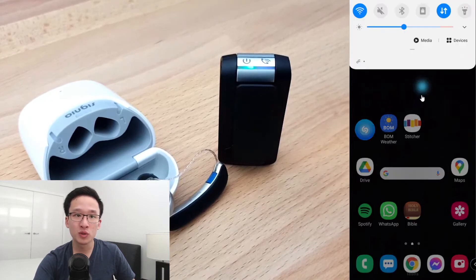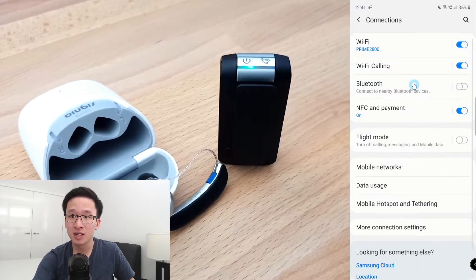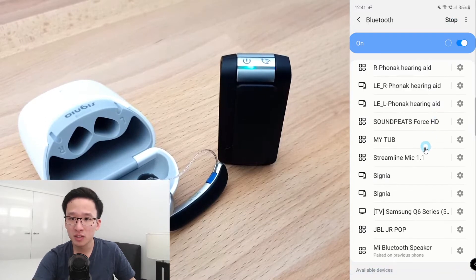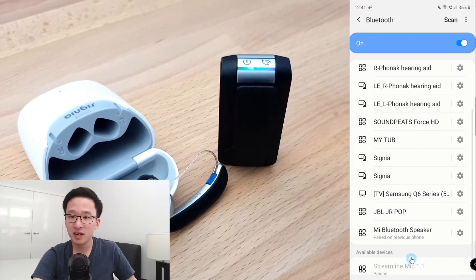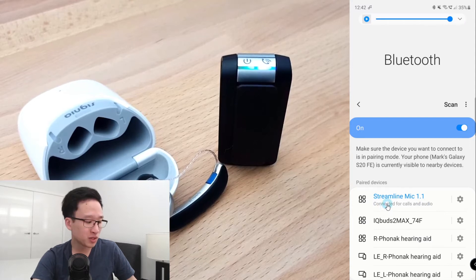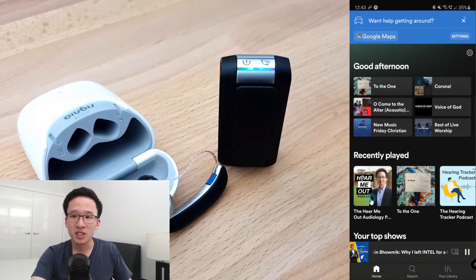Go to your Android phone, swipe down from the top, and click on the Settings tab. From there, go to the Bluetooth tab — on a Samsung phone it's under Connections and then Bluetooth. Turn on your Bluetooth and begin scanning. Scroll down to the bottom of the page and after a while you should see the Streamline Mic pop up. Click on it and start pairing. It will ask you whether you want to pair with the Streamline Mic 1.1 — press OK and you will now be connected. When a Bluetooth device is connected, it glows blue. Now you can stream music, movies, or calls from your phone to your Signia hearing aids.